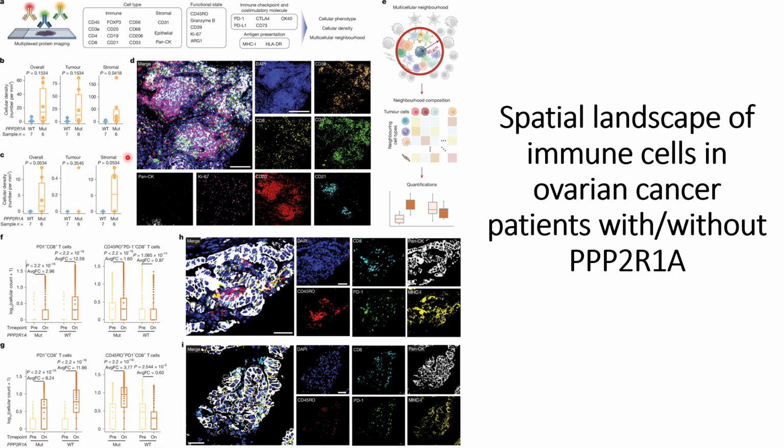Once they identified that in the mutant case there is an increase in the immune cells, in the tumor region and also in the stromal region, they did immunostaining, and they are able to find that in the mutant conditions, they see TLS formations, that is, tertiary lymphoid structure formations occur. This can be seen in panel D, where the markers CD20 and CD21 show the presence of this TLS.